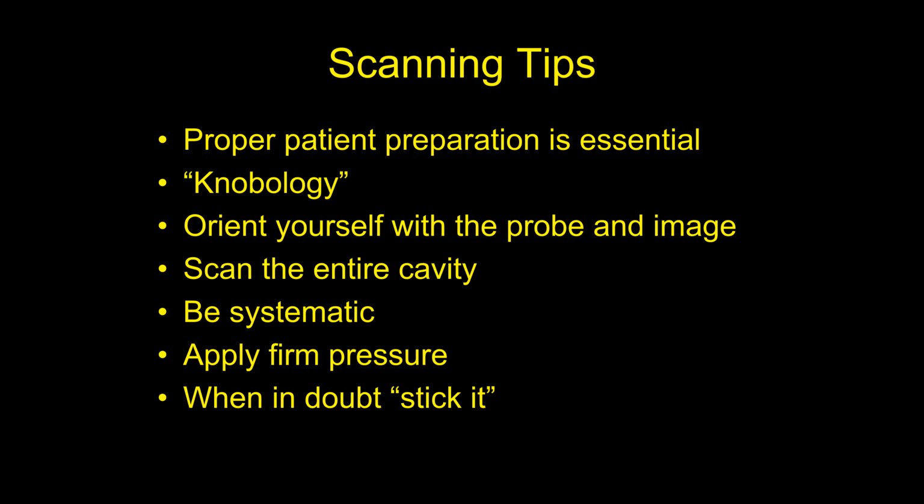And you people that have grown up with video devices and playing video games and stuff like that, you definitely have an advantage because you are used to playing with the controller down here, but you're not looking at the controller. Okay. You're looking at the monitor of what the controller is doing. Okay. If you try to train older practitioners, even older than me, how to do this, they get really confused because they want to look at their hands. Okay, they want to look at what they're doing. And so they'll sit there and they'll stare at the dog's belly where the probe is.